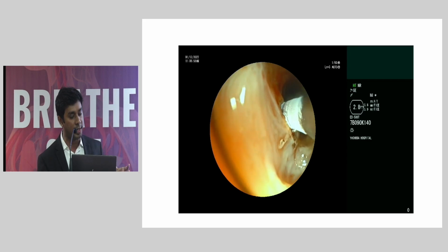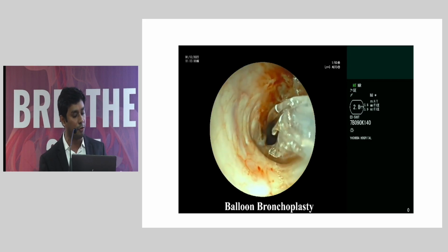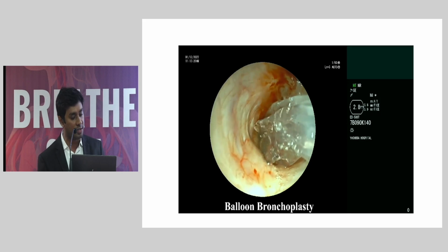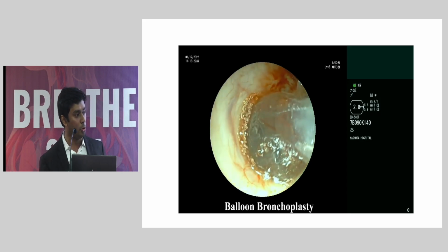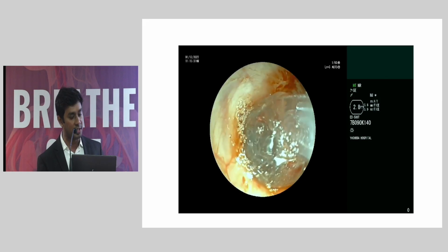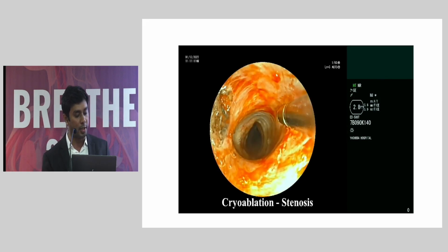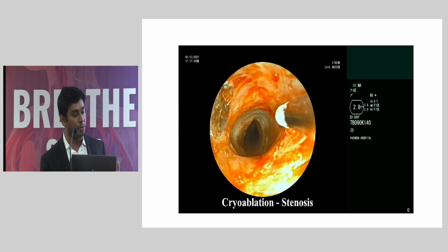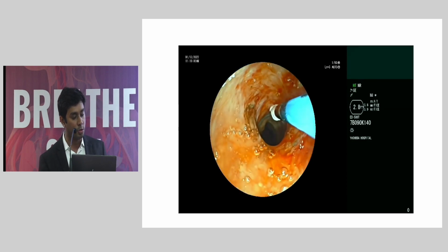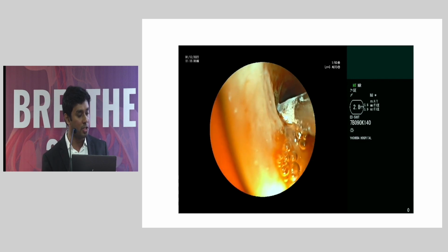So once we dilate the airway, we use this cryoablation so that it causes the destruction of the fibrotic cells and prevents the chances of restenosis. And what we are doing here is nothing but a classical balloon bronchoplasty, which means we take the CRE balloon, we dilate the airway, and we make sure that the airway is appropriately dilated. Again, as you can see from here, we are using the cryoablation so that the restenosis doesn't happen. And sometimes we even give intralesional steroids.